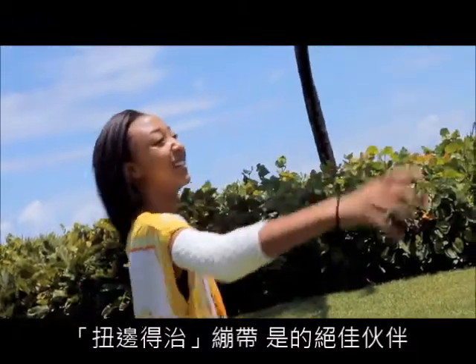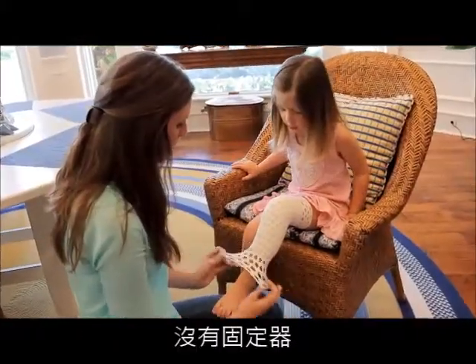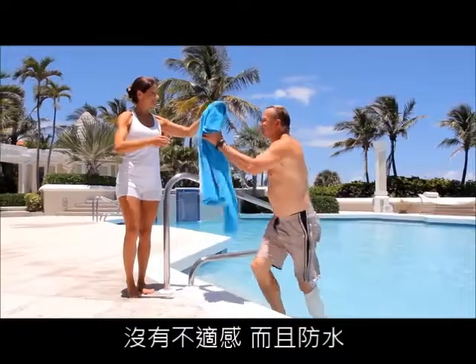New Bandage is an excellent strategy for burns, skin grafts, wound care, and perfect for our elderly and our children. There's no fasteners, no buckles, no tapes, no adhesives, there's no latex, there's no discomfort, and it's waterproof.